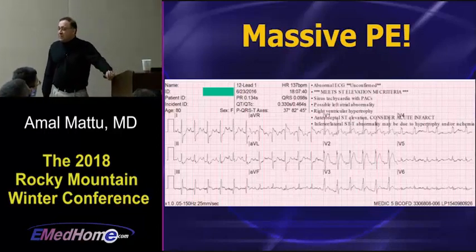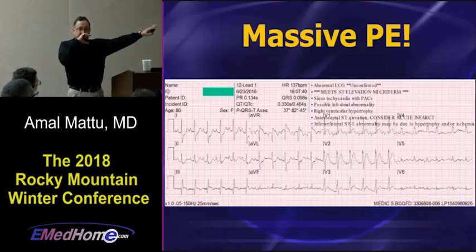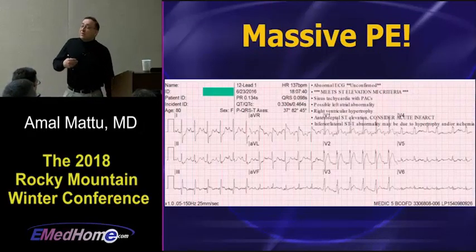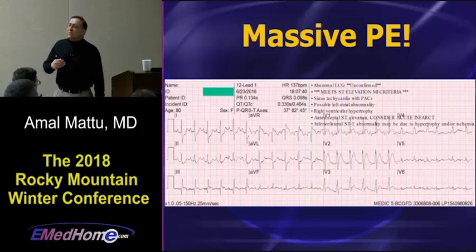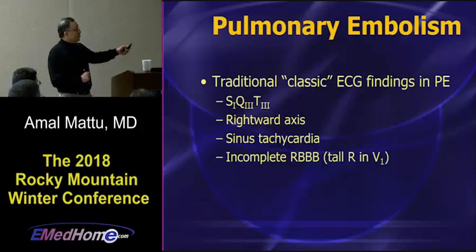This was not a STEMI. This was a massive PE. And actually, this ECG shows you what I would consider almost all of the very classic findings on ECG in PE, which we'll go through in just a bit.